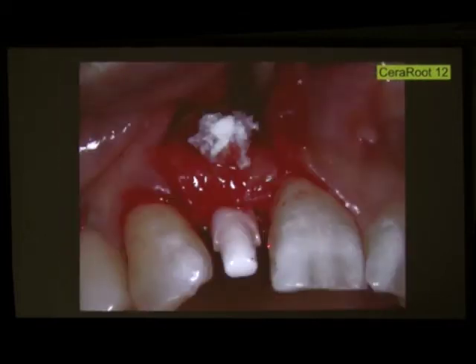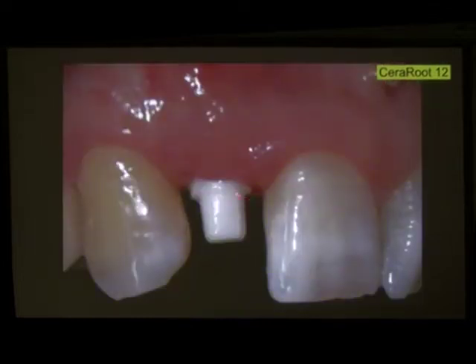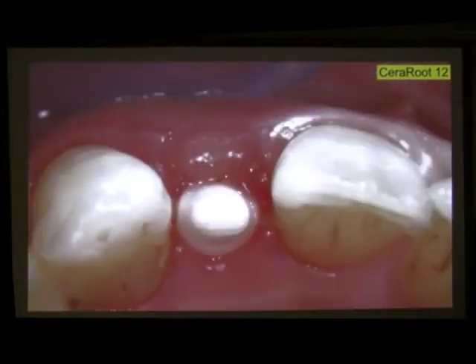Look at the distance that we have from the margin of the implant to the bone, probably about 3 millimeters. And when the patient comes 4 months post-op, the margin of the implant is at gum level. Distally, the margin of the implant is a little bit supragingival, but because this is the distal portion of the implant, many times we do the crown sitting on this margin, so we don't prep this margin. Over time the crown protects the gum due to masticatory forces, and we can see many times the gum creeping and covering parts of the implant that were visible.